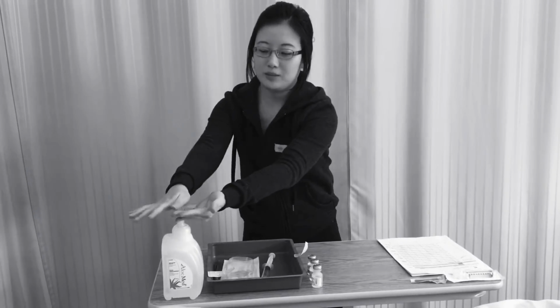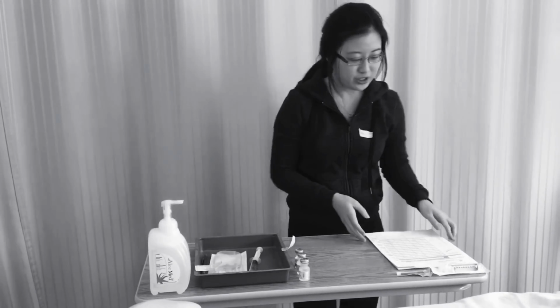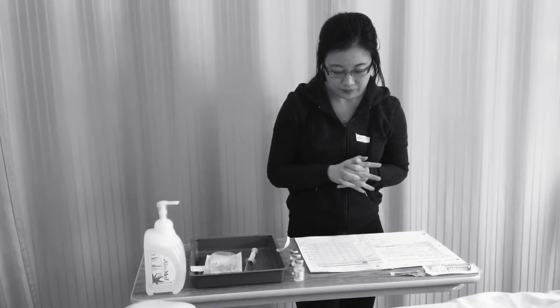I'm a student nurse, and today I'll be showing you how to reconstitute an IV med and deliver it via the CIVA pump. So I'm going to do hand hygiene, and I'm going to check my doctor's orders with my MAR. My patient today is Tyrone Banks, and he is 55 years old. He has arthritis and diabetes.